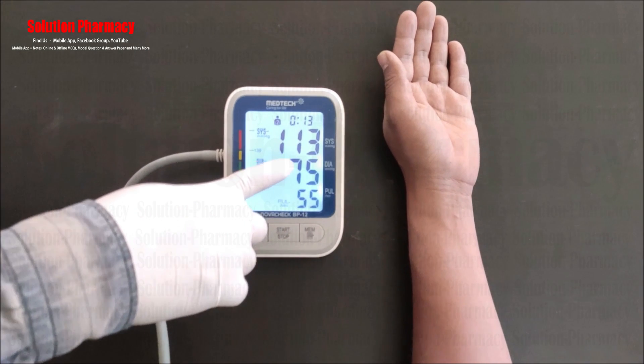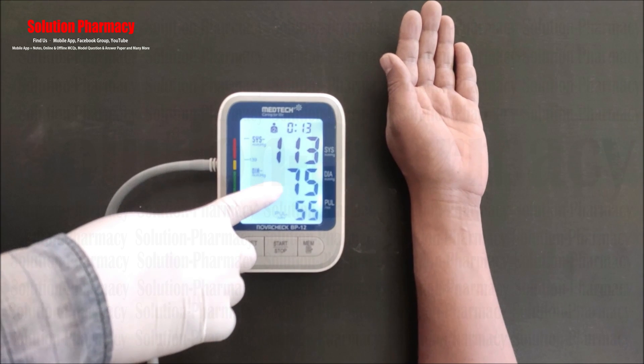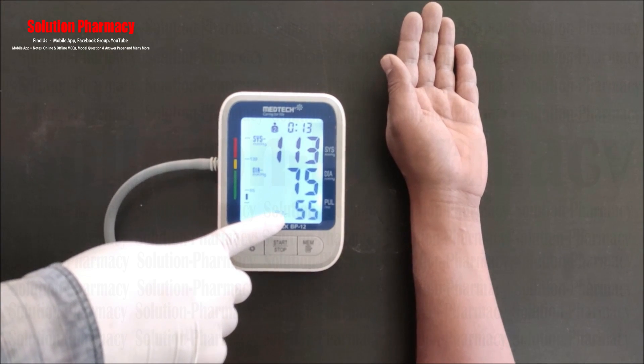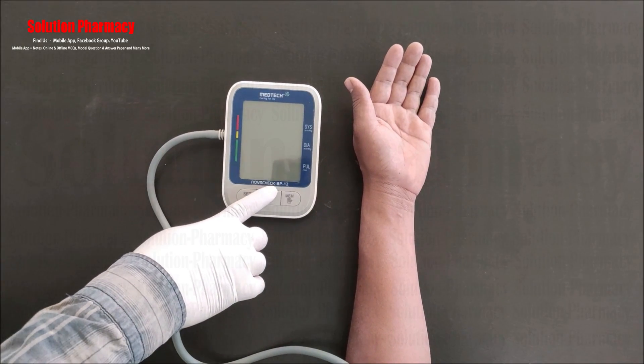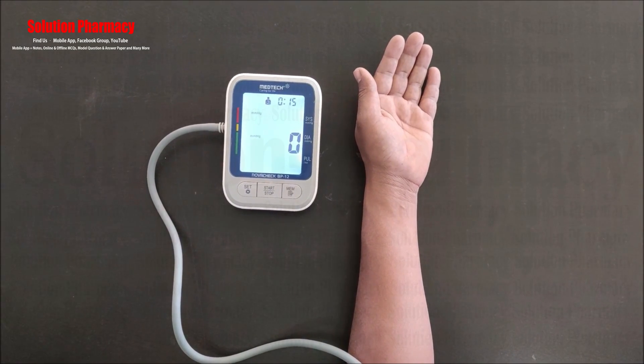After the measurement, you can see on the display: systolic pressure is 113, diastolic pressure is 75, and pulse rate is 55. So the obtained blood pressure of this person is 113 over 75.